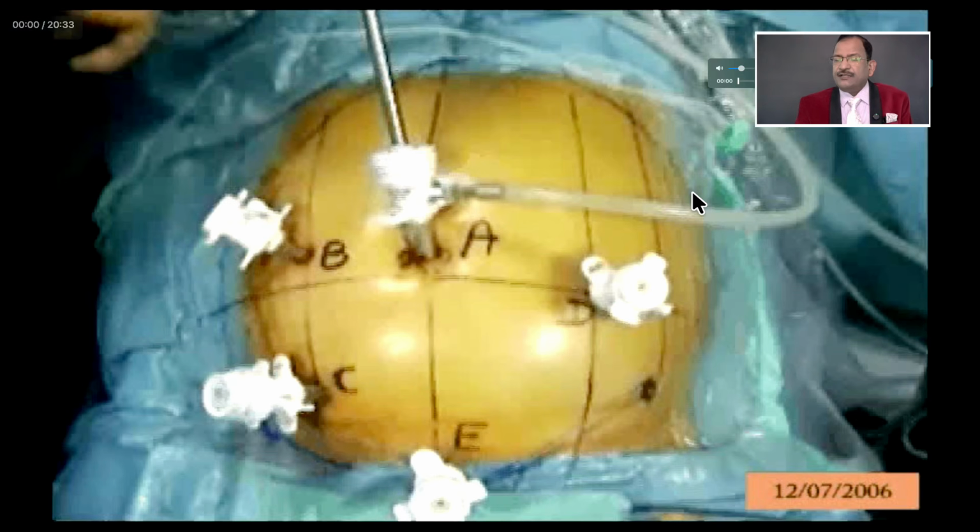You can see this is a benign sigmoiditis, and because it is a benign sigmoiditis, you don't need many ports, but still you have 5 ports.